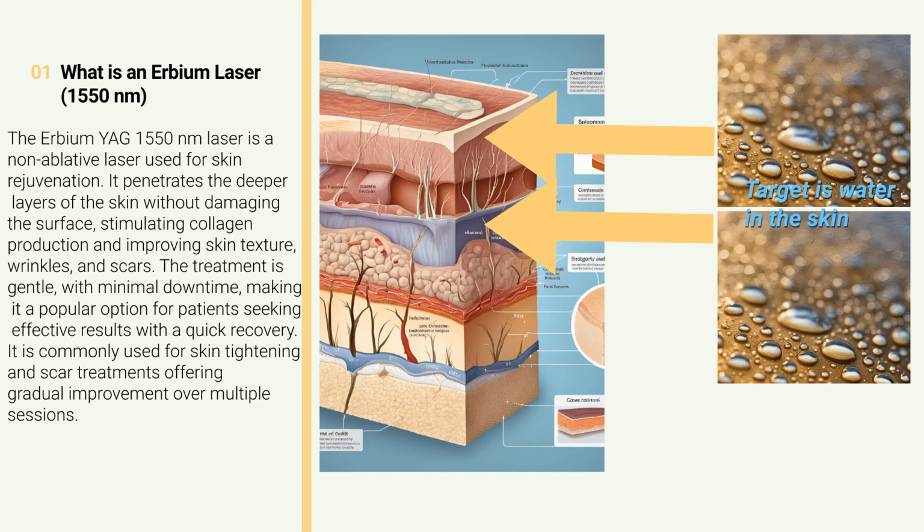It's mainly used for skin tightening, treating wrinkles, and scars. Patients usually experience mild redness or swelling, but can return to daily activities quickly, within hours after receiving treatment. In some cases, some minor peeling may occur, comparable to a minor sunburn.